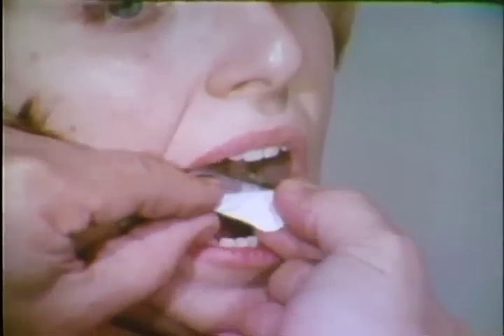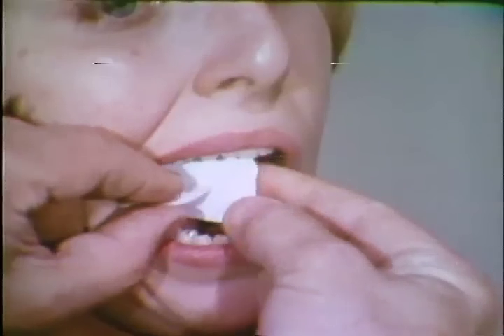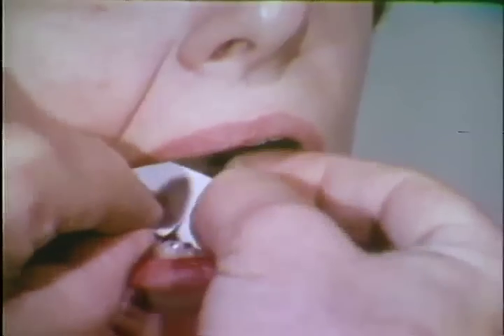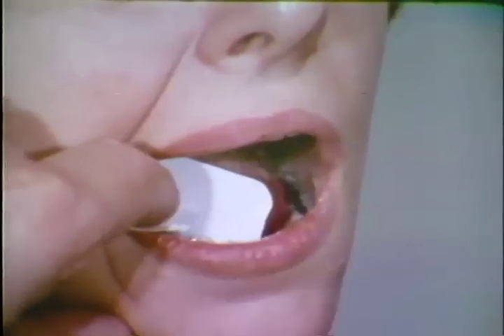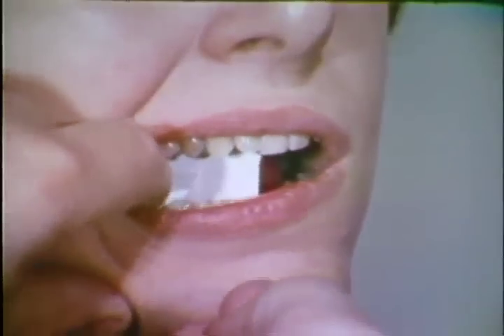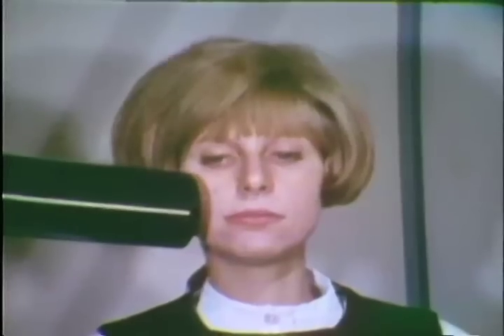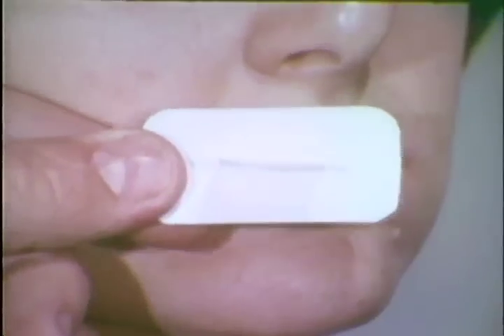Utilizing the same principles, the film packet is now inserted into the mouth of the patient. With the film packet properly positioned, the previously aligned X-ray cone is lowered, or the chair and the patient are raised to a position where the center of the beam is directed at the occlusal surfaces of the teeth. Lips are closed, and the exposure is quickly taken, and the film packet removed. Note that the end of the bite tab has remained parallel to the long axis of the film.